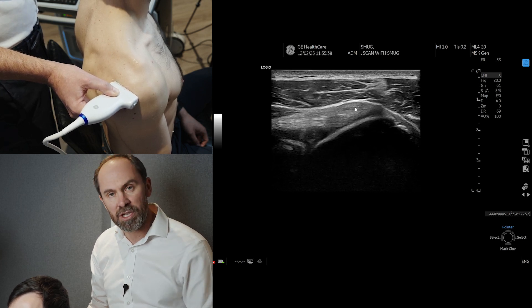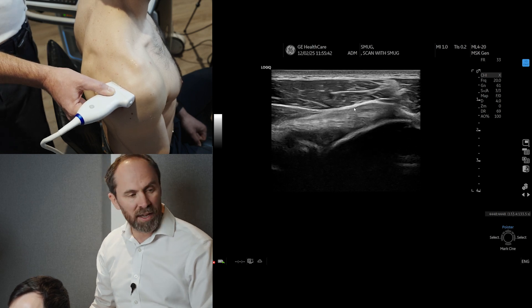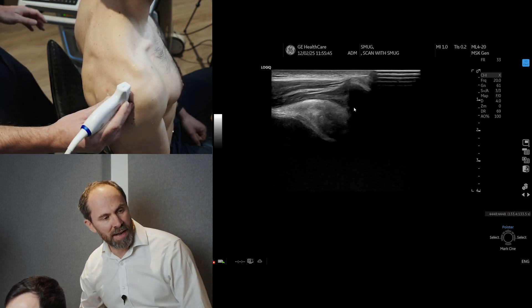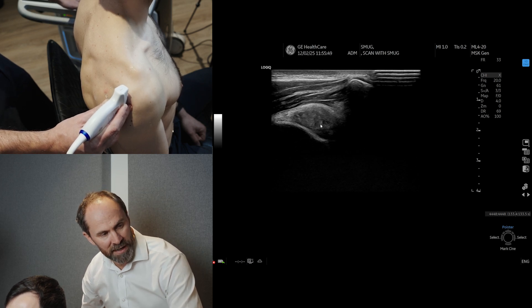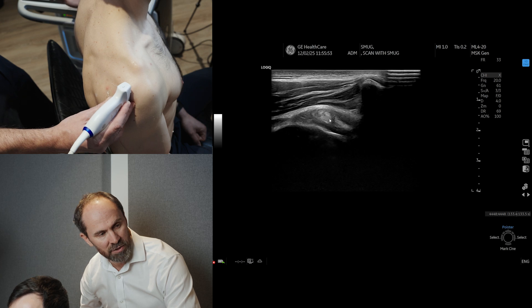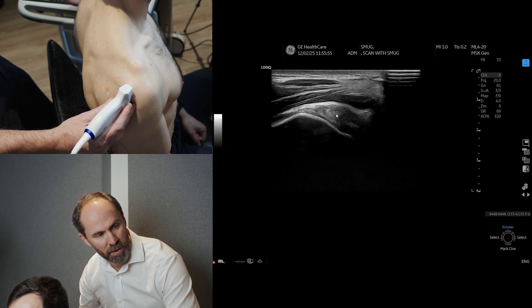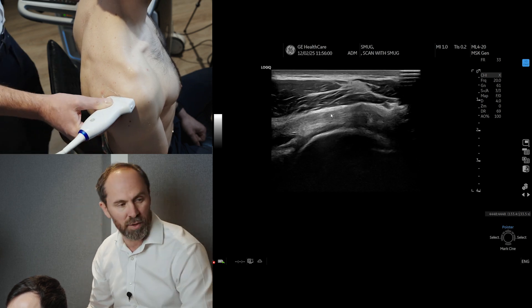If you go into a bit more rotation, can you see his tendon here actually gets a little bit thicker? So he has got a bit of tendinopathic change on those superior fibers of infraspinatus. And like everything, I would need to confirm that in transverse section. Can you see it is quite heterogeneous, just on those superior fibers, and it's certainly a little bit thicker. I'm confirming that in two views.